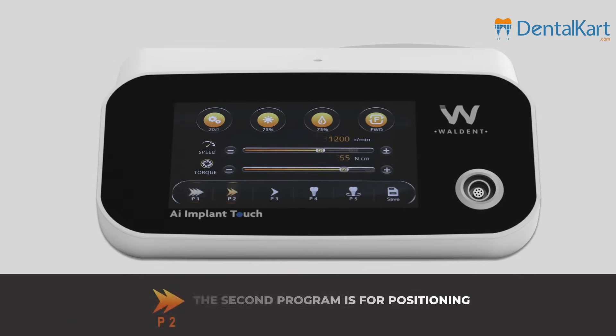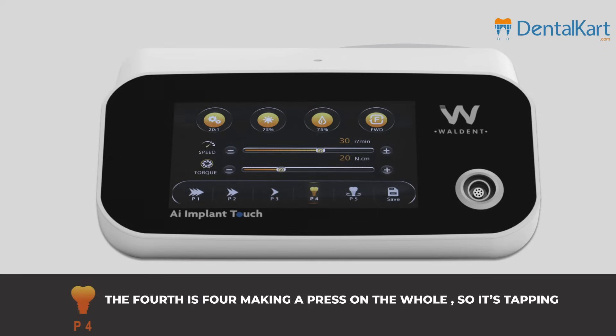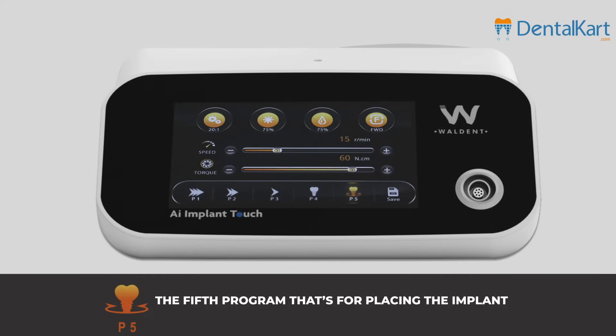The second program is for positioning, the third is for hole drilling, the fourth is for making a press on the hole, so it's tapping. Then we have the fifth program, which is for placing the implant.